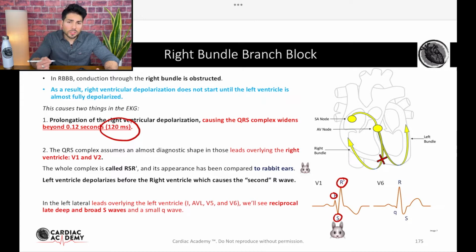The reason you're seeing this is just like we said, the right bundle is blocked. So the left bundle depolarizes first, and after the depolarization is almost complete, then it starts depolarizing the rest of the ventricle using something other than the right bundle. So it's very inefficient in doing so. So the QRS is going to widen, it's going to take longer. And then you're going to see the specific morphology, the bunny ears, okay?